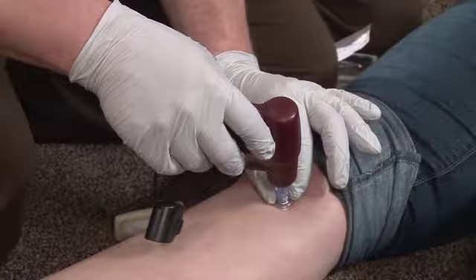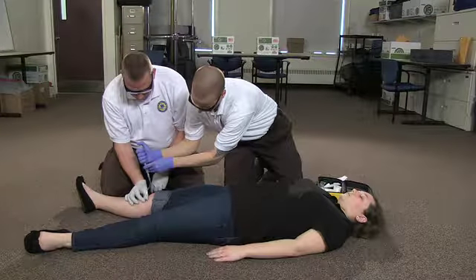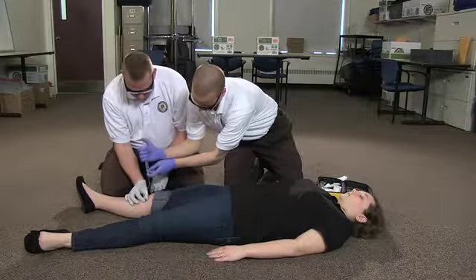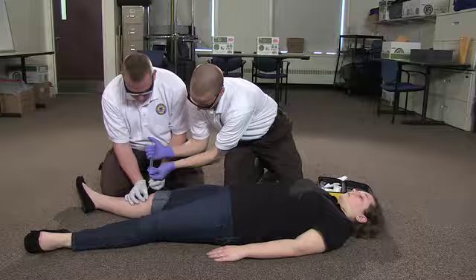The provider attaches the syringe with saline to the needle hub. The syringe plunger is drawn back slightly, and the provider looks for fluid from the marrow cavity to mix with the saline. Dry taps are not uncommon with this procedure and may be due to a bone plug in the intraosseous needle. Next, the provider injects 5 milliliters of saline, observing for signs of infiltration. This infusion will also clear any bone plug that may be present.